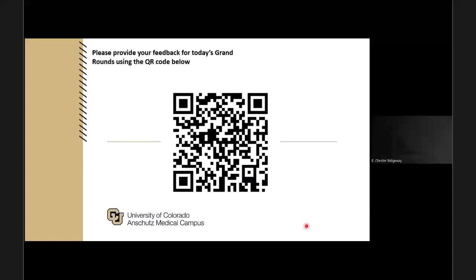Thank you, Dr. Robb. If you have questions, please raise your hand or type them in the chat, and I'll start out. Speaking of how to order chest x-rays, question I always have. So when we go to actually order it, we get prompted with different questions. For example, what symptoms is the patient having? What questions do you want answered? Scheduling, other. First, two-part question here. So first of all, what information from that actually gets through to you? And secondly, how much or how little is helpful for you?